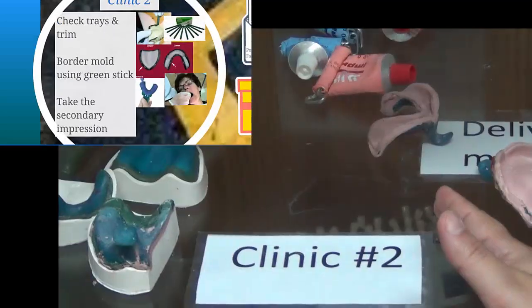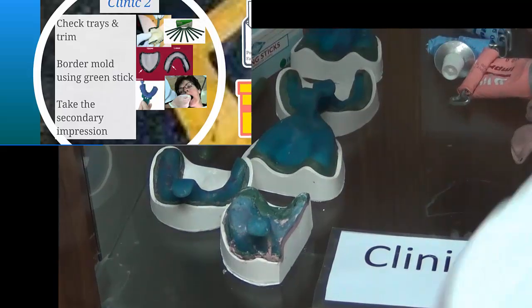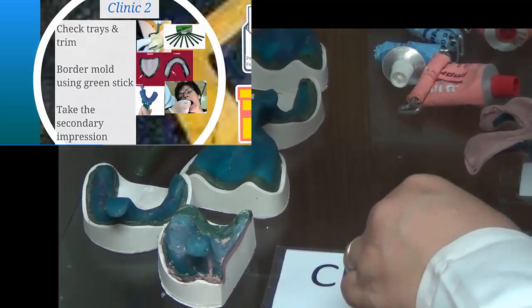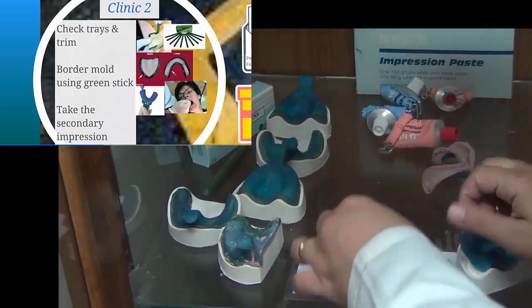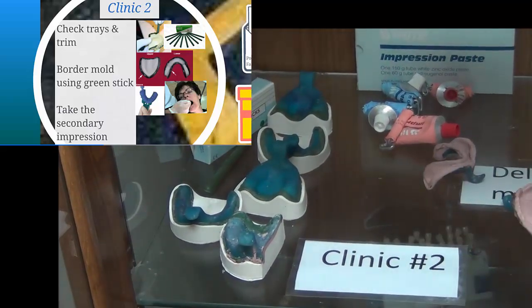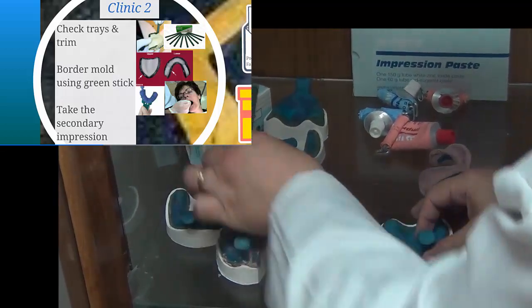What do we do in clinic number 2? So this is clinic number 2. The patient came back in the next clinic. We had our trays from the lab. We checked their quality, whether they are good or not. If there are any sharp areas and extensions that should be removed, we check them inside the patient's mouth as well. And once we finish checking them, we add a material called green stick.